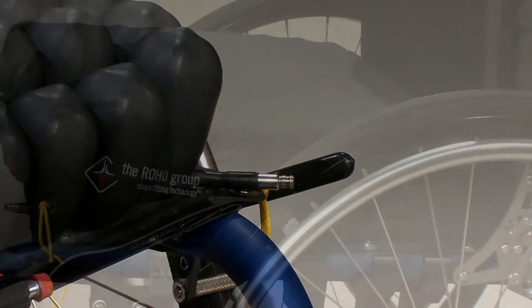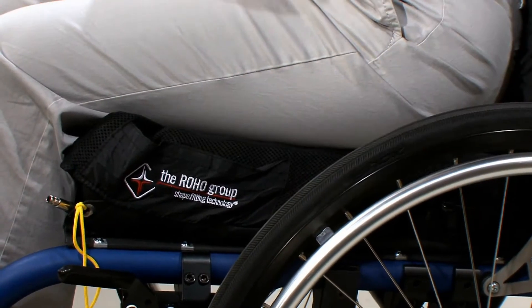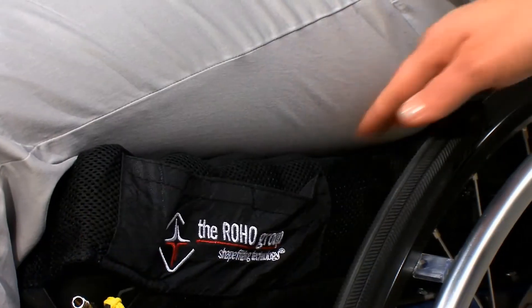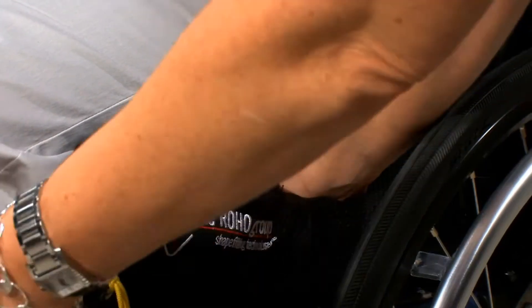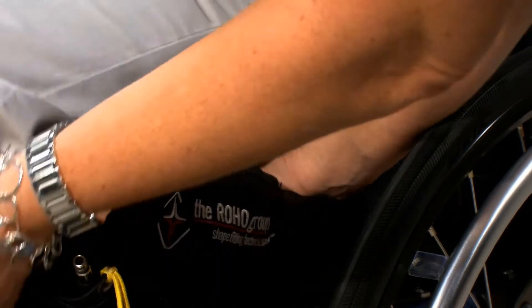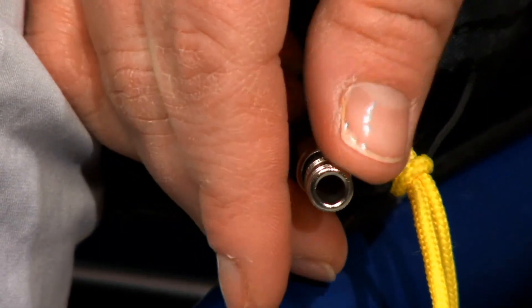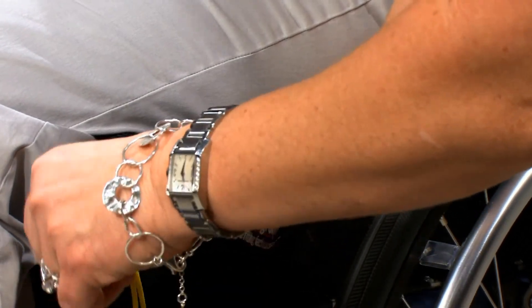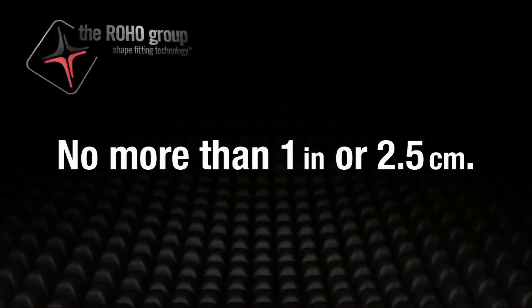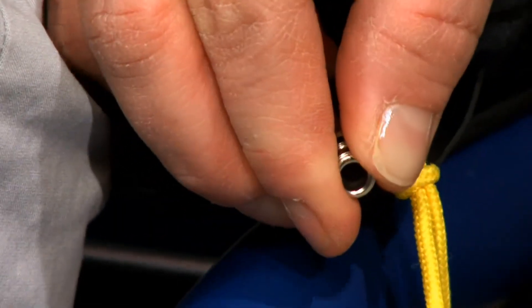Have the individual sit in the wheelchair, making sure the cushion is centered underneath. The individual should be seated in their normal sitting position. Next, slide your hand between the cushion surface and the individual's bottom. Lift their leg slightly and feel for the lowest bony prominence, then lower the leg to a sitting position. Turn the air valve counterclockwise to let air out while keeping your hand under the individual's lowest bony prominence. Release the air until you can barely move your fingertips — no more than 1 inch (2.5 cm) and no less than half an inch (1.5 cm). Turn the air valve clockwise to close and stop the flow of air.